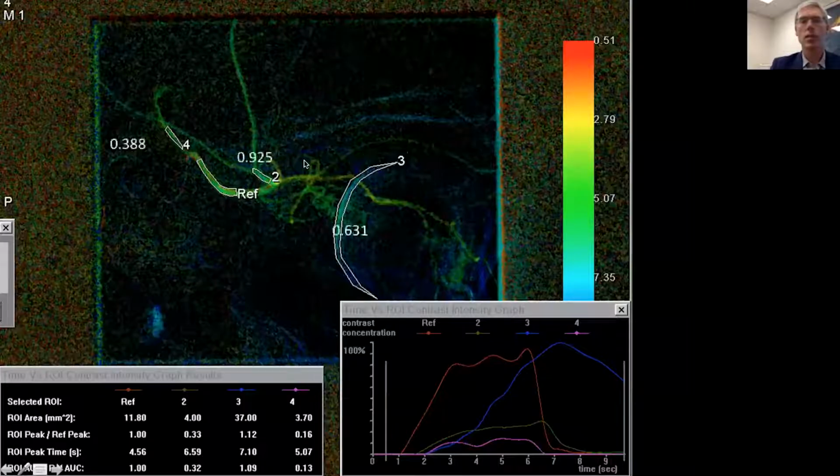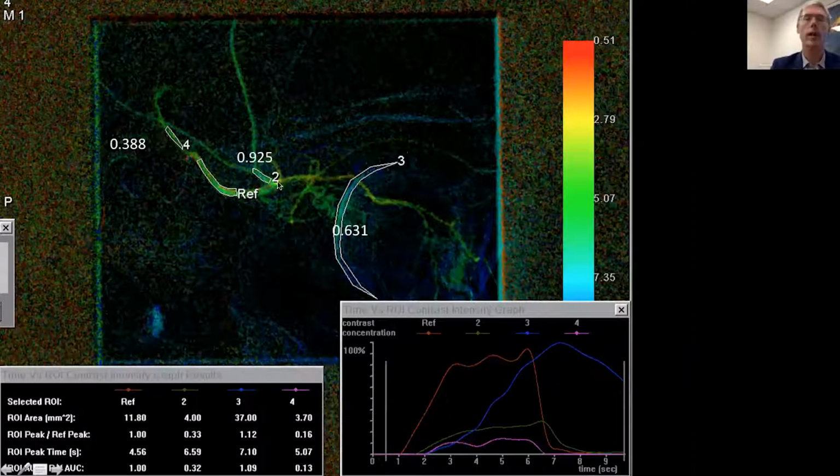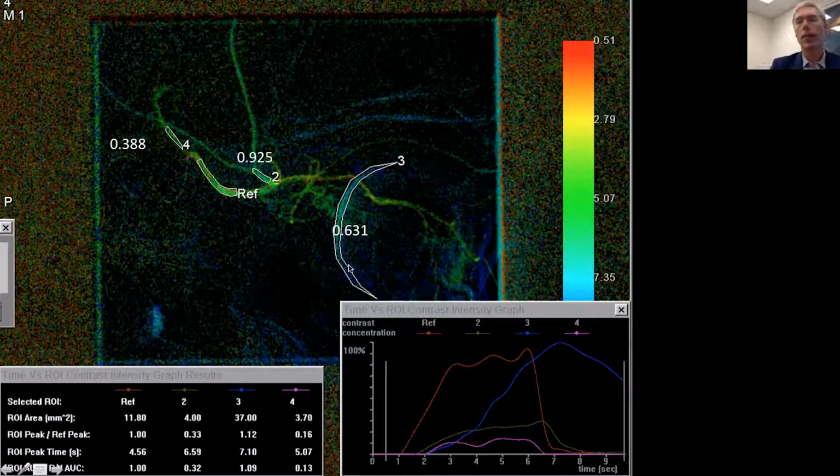This is a paper we published just talking about how to reduce radiation exposure in these delivery methods. And so this is another, again, I mentioned that parametric color coding. This is that same type of technology. What we're looking at here is trying to better understand, as you have collateral inputs, so this is the meningolacrimal component off of the external carotid artery that communicates with the ophthalmic artery, how they dilute the chemotherapeutic as it goes to the choroid. Here's the choroidal blush, and then how that affects outcomes.